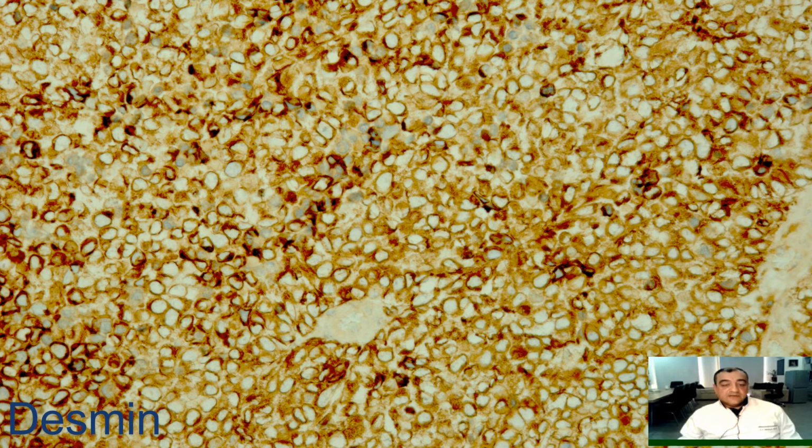It must have this kind of reaction, very intensive cytoplasmic staining, because desmin very often causes non-specific, moderate to very weak cytoplasmic staining in any kind of tumors, even in some carcinomas.